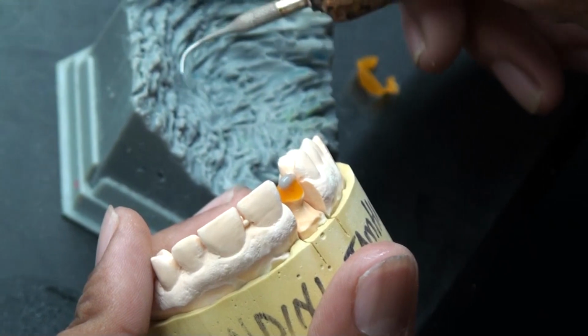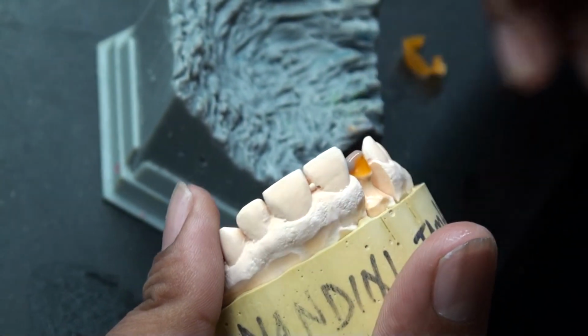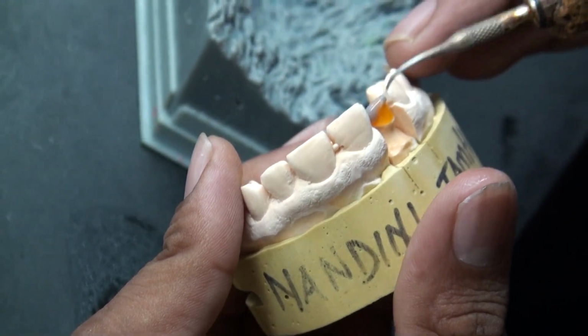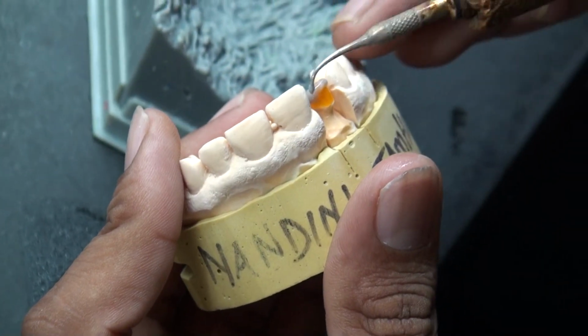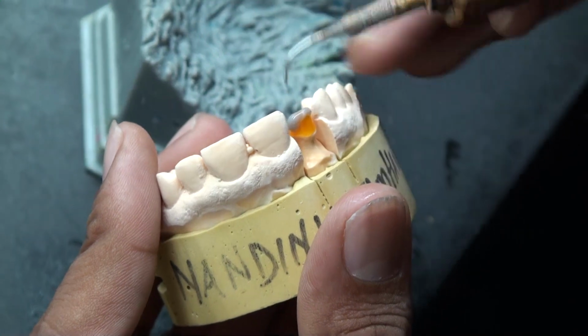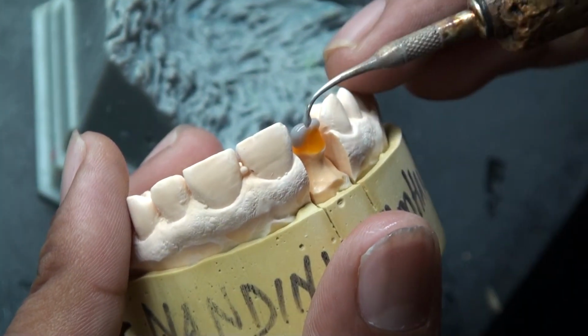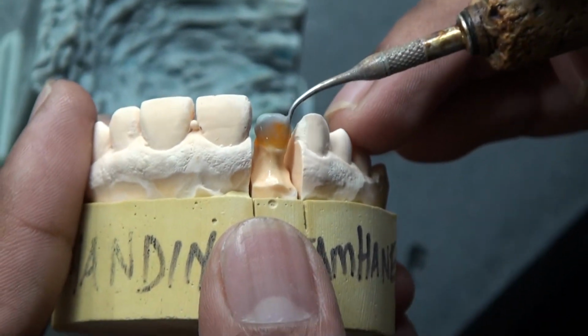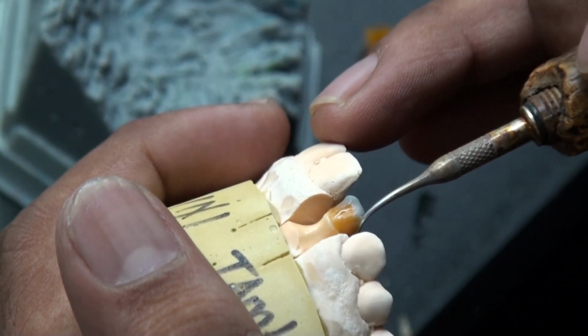So this is the critical part where you can see it's a very skilled job. He's got a heated instrument and he's taking some wax and actually manually adding all the wax onto the prep. This is very skilled. I've tried to do it. I often do it just because I have an interest in it, and I get to learn a lot about the shapes and anatomies.